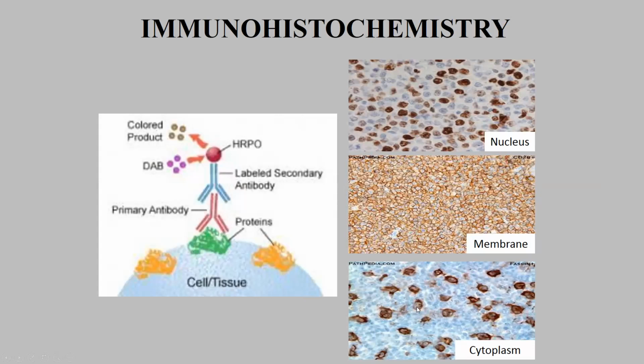It's combined localization. Usually, a primary antibody against some pathological protein or some receptors, etc., is marked by some colored product like diaminobenzidine, or phosphatase, or another substance like particles of gold, or some fluorescein substance.